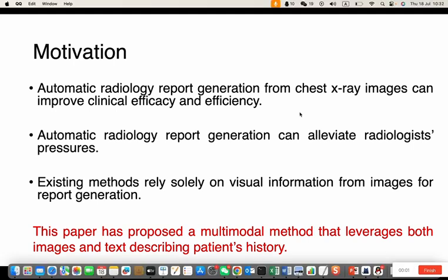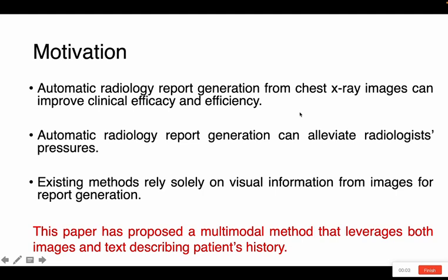Many researchers are working on this, but most existing methods rely only on visual information from images for report generation. But we propose a multimodal method. We use both the images and the text describing the patient's history to generate the report.